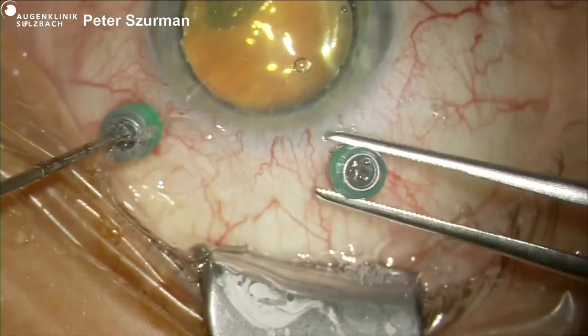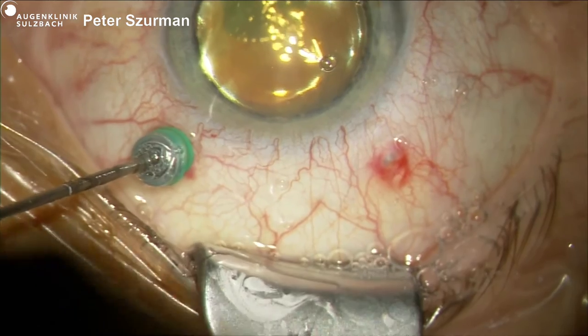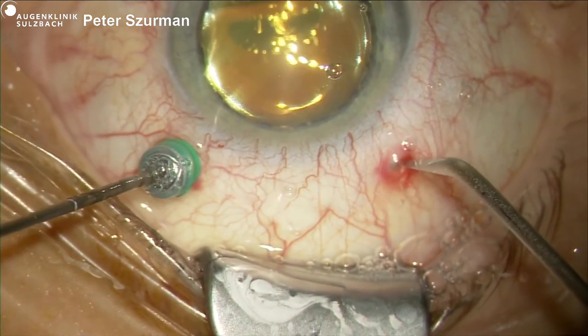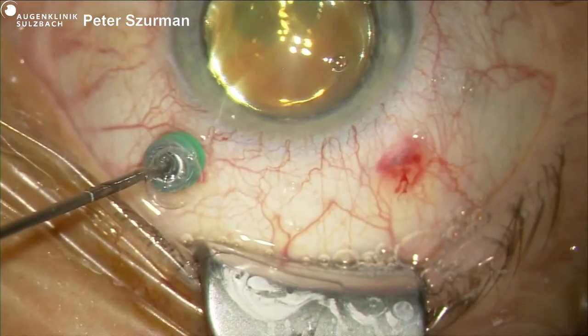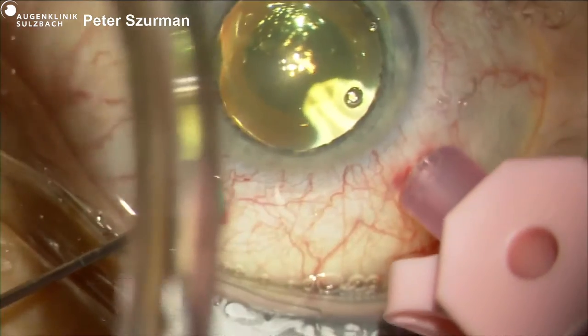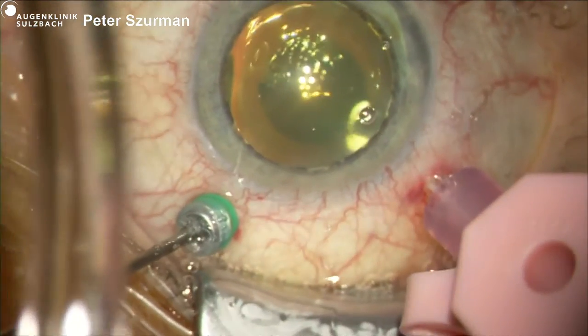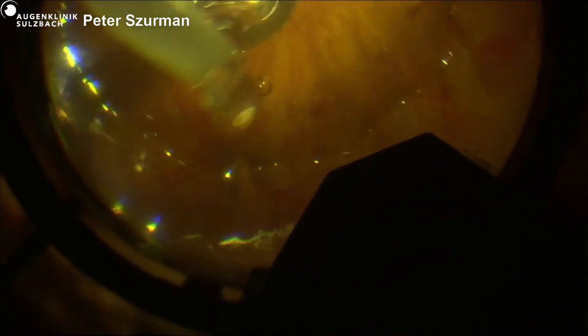So, Tommaso, what is your approach with this patient? Optic disc pit, every case can be different. What is your approach for this one? Okay, so the first problem was the previous intervention that she has. And as you see, the retina is a little wrinkled. So she had a lot of synechiae, and the mydriasis was impossible at the slit lamp. So I have to put this iris hook to have it, and then there is a little amount of laser here.